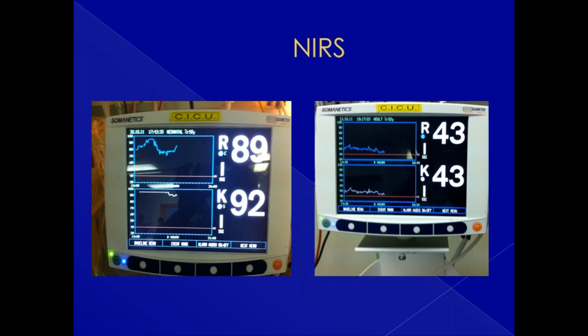The second situation is also worrying here because the somatic saturations are low and cerebral saturations are also low. So both the situations are worrying. It wouldn't be like that.